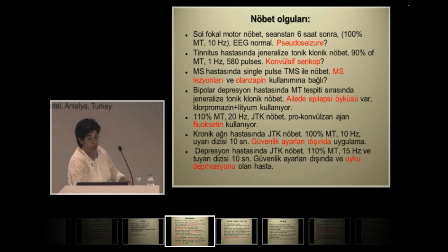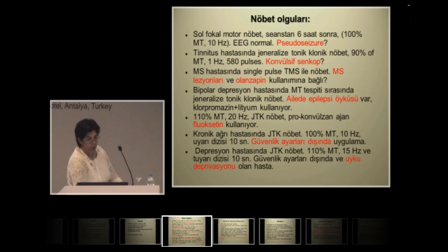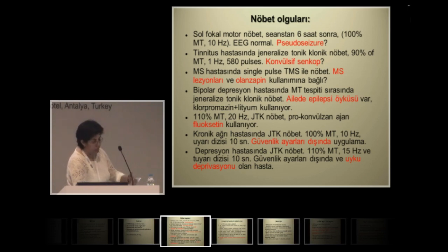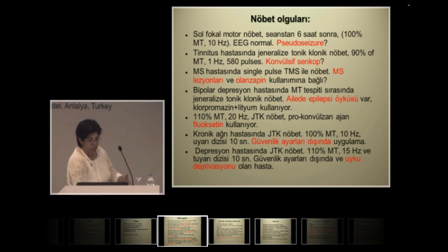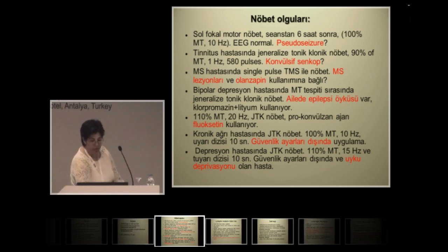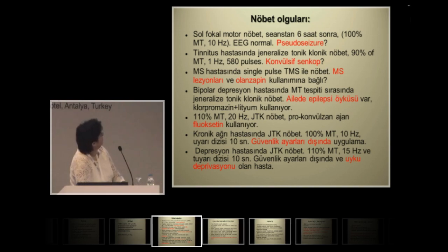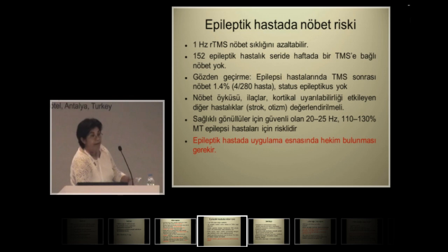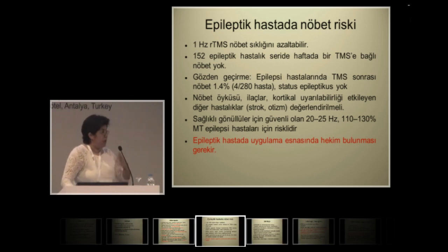In one patient, there was a history of epilepsy in the family, and the patient was on lithium and chlorpromazine, and there was another seizure. Another patient was using a proconvulsant agent, fluoxetine. In all the other patients, there was an application that is beyond the safe range, and there was sleep deprivation in another patient, and therefore we assess those risks in our patients.